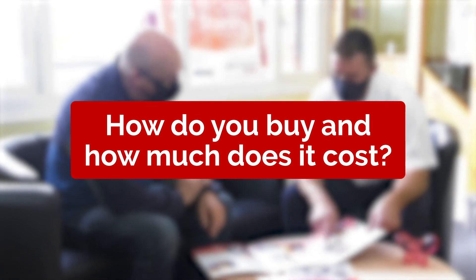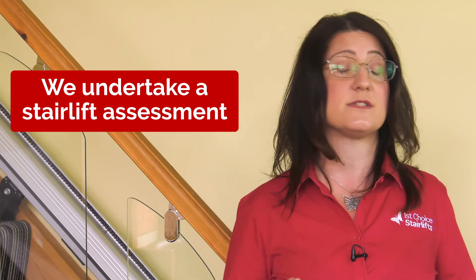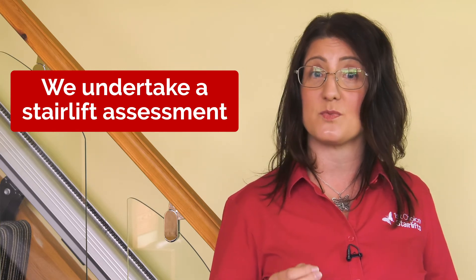How do you buy and how much does one cost? We make sure we get the right model that is comfortable and safe to use. As stair lift experts, we undertake a stair lift assessment where we look at your stair dimensions, your dimensions and your mobility needs, and match this with the most suitable model for you and your stairs. We will also check if you have a power point nearby. This assessment usually takes about an hour, and we provide you with a no obligation quotation and answer all your questions. This is a free service with no high pressure selling involved.